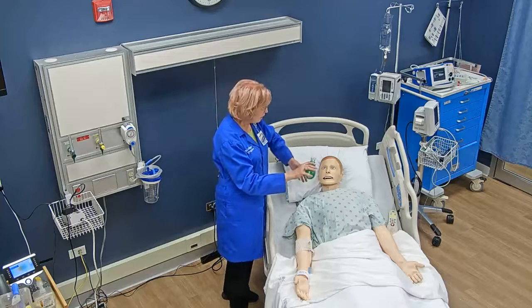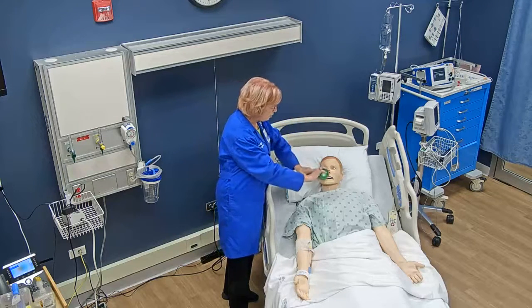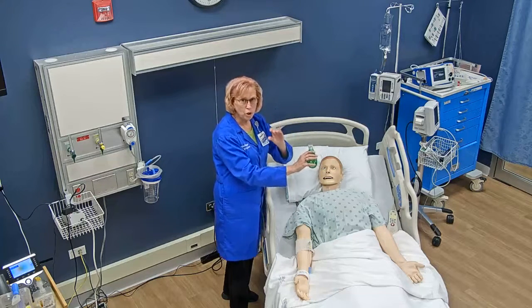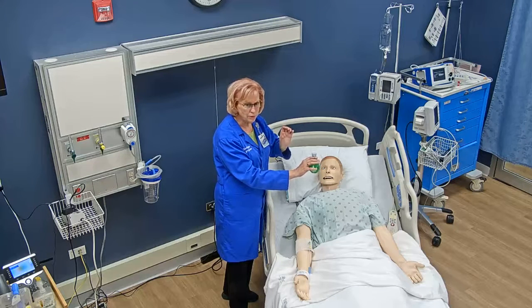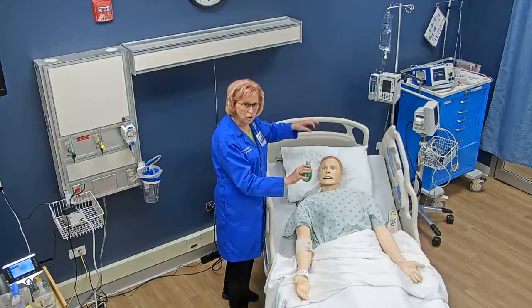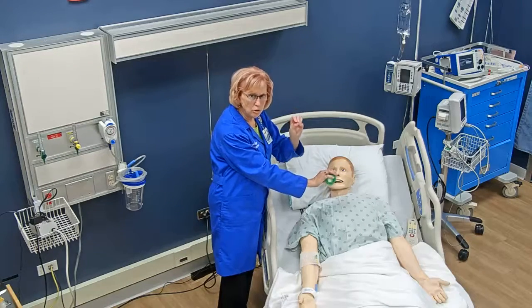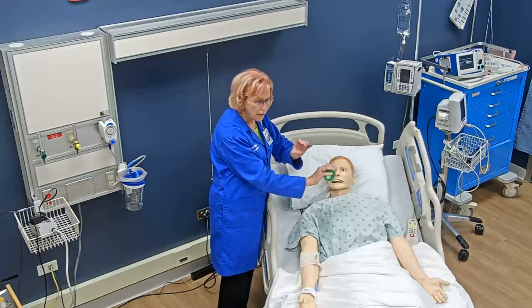Instruct your patient to take a nice deep breath in, hold the breath for two to three seconds, then put the device in the mouth, make a seal with the lips on the mouthpiece, and blow out at a moderate speed — not too fast and not too slow. The exhalation should be about three to four times longer than inspiration, at least about three to four seconds. Then the patient can rest and repeat the cycle.